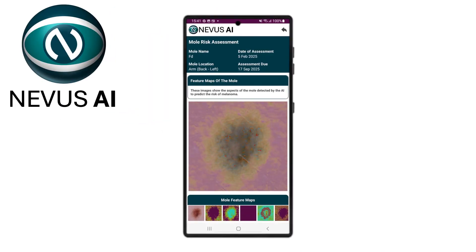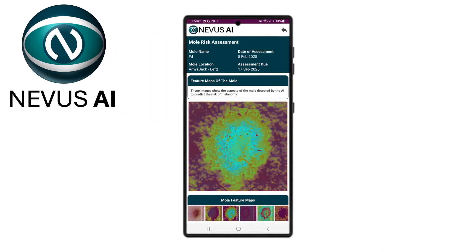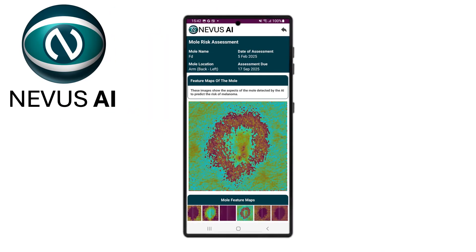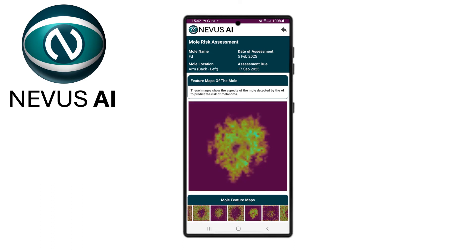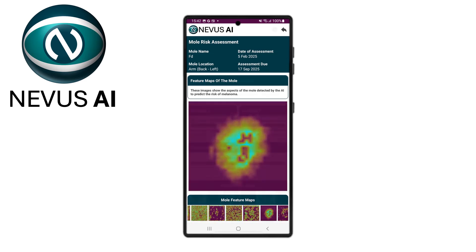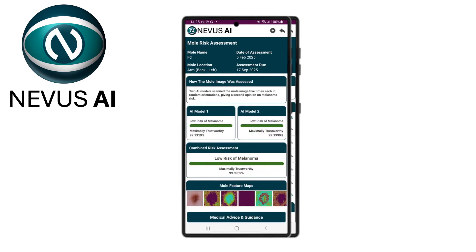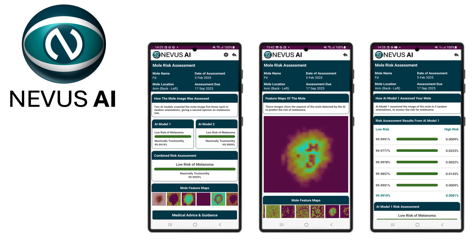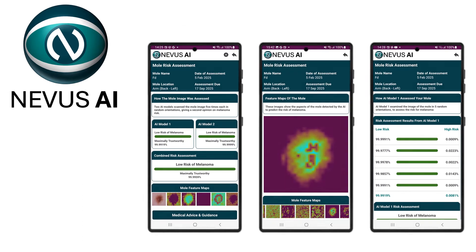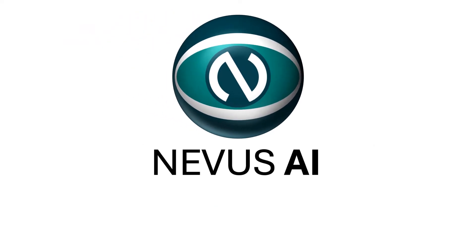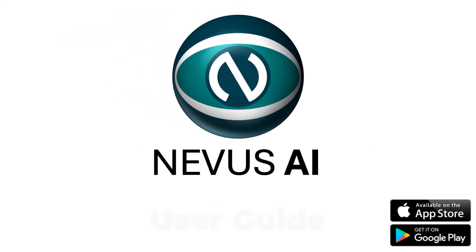Nevus AI allows you to take an image of your mole to provide an immediate risk assessment for melanoma. Download Nevus AI on your mobile device.